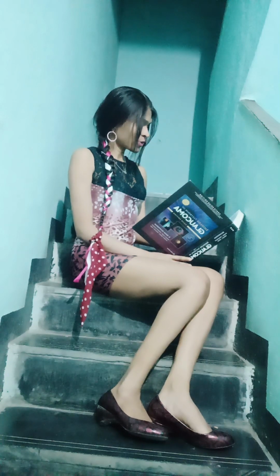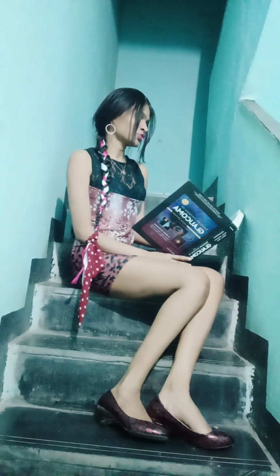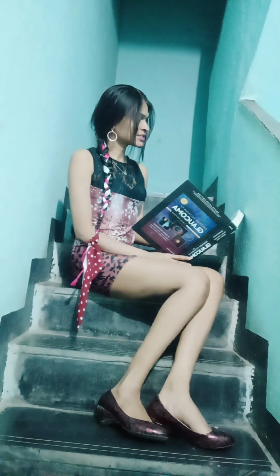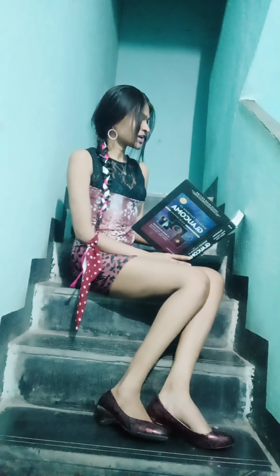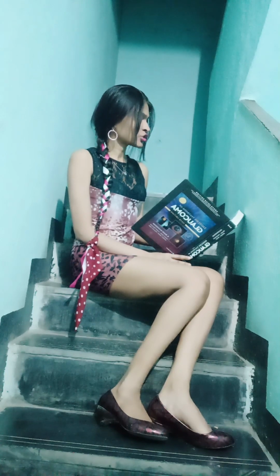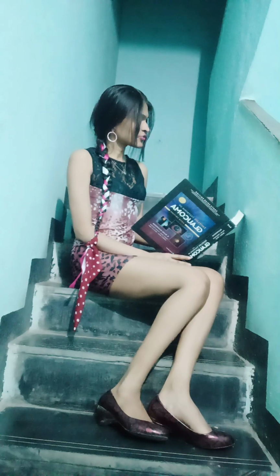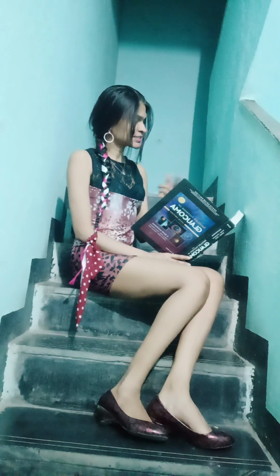The solution to this problem is to eliminate the cornea-air interface by using a gonio lens or gonioprism. Because the index of refraction of a contact lens approaches that of the cornea, there is minimal refraction at the interface of these two media, which eliminates the optical effect of the front corneal surface. Therefore, light rays from the anterior chamber angle enter the contact lens and are then made to pass through the new contact lens-air interface by one of two basic designs.